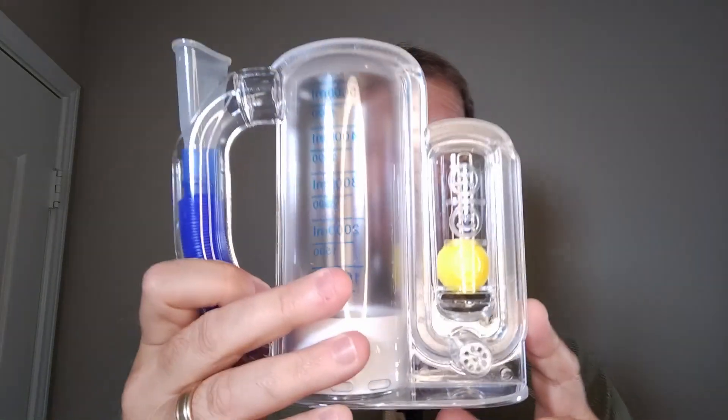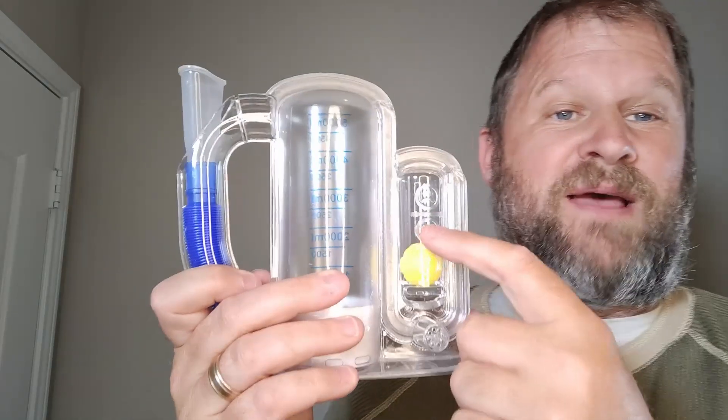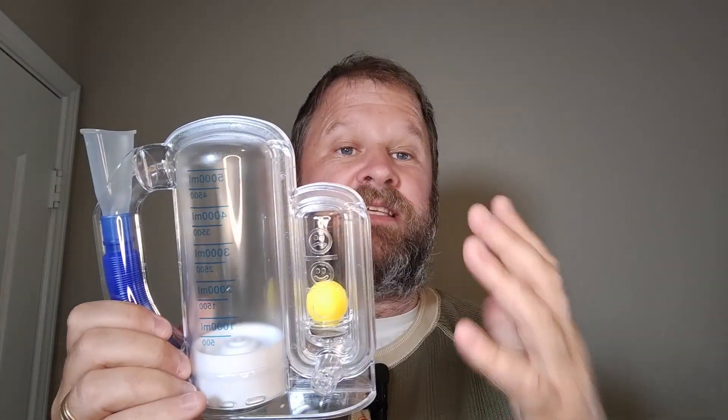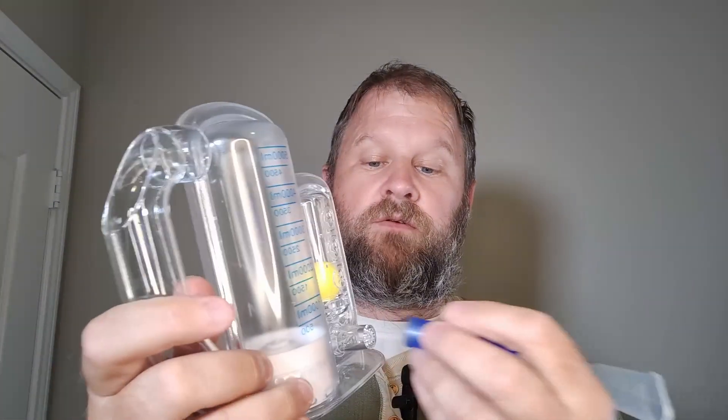So we're going to take the plastic off and show you what it came with. It came with a little directional thing, but I checked out YouTube on how to properly use this. And I love how it has this frowny face and a smiley face. So you want to keep this little ping pong ball sitting right there. And you don't want to exhale — this is an inhalation device. So we are going to take out the little tube. This is what we're going to need to blow into.